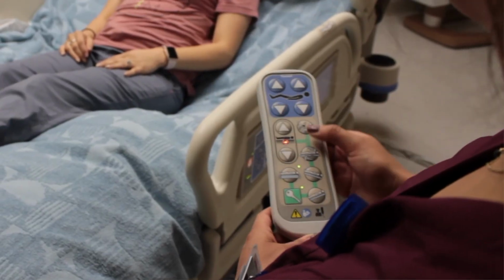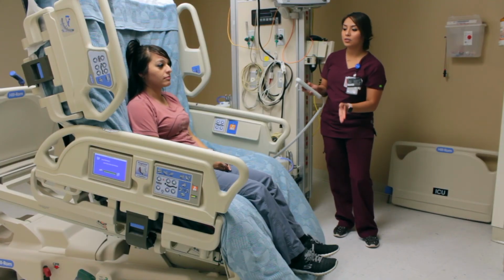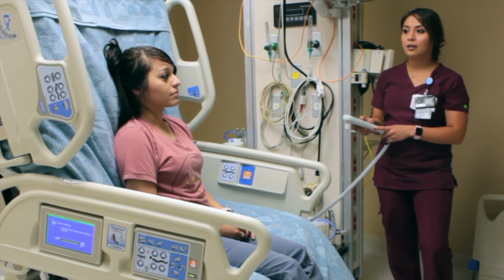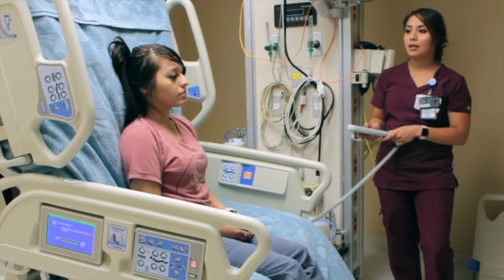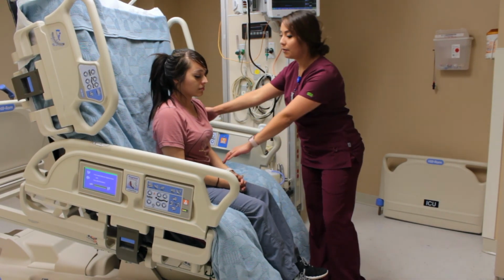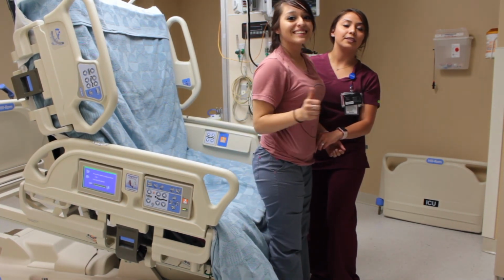Now the seat is deflating, so it does deflate their bottom to help get the pressure off of their bottom in the sitting position. And it helps to just push her back up and prevent her from sliding out of the chair. And this position is also really beneficial to our patients. That way they can eat in a sitting position, prevent their risk of aspiration. So at this time we would put our gait belt on our patient and just kind of help them stand up as easy and safely as we can. But if you see, it basically has our patient in a standing position.